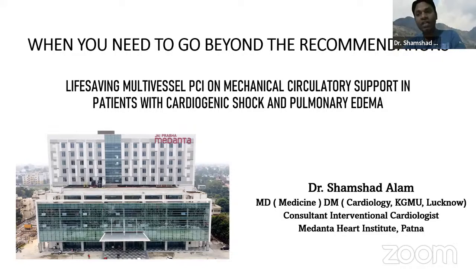But at times, it becomes necessary to do multi-vessel intervention, because suppose we are not able to get good flow through the other vessels, and the vessel which you are intervening on has already infarcted a lot and is not going to help that much, then obviously you have to give that support from other vessels. So let's start with the first case.